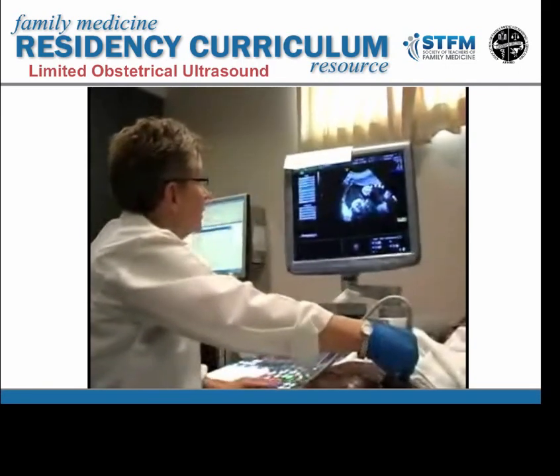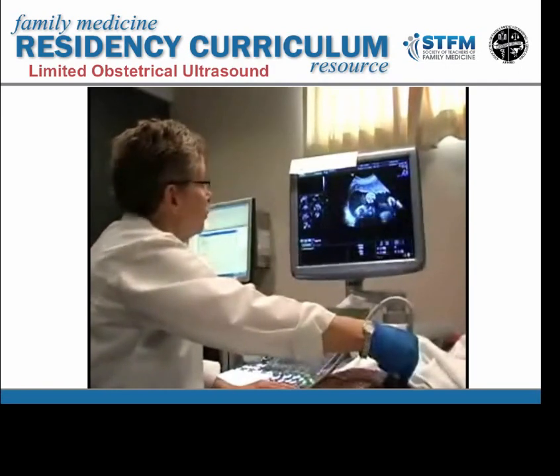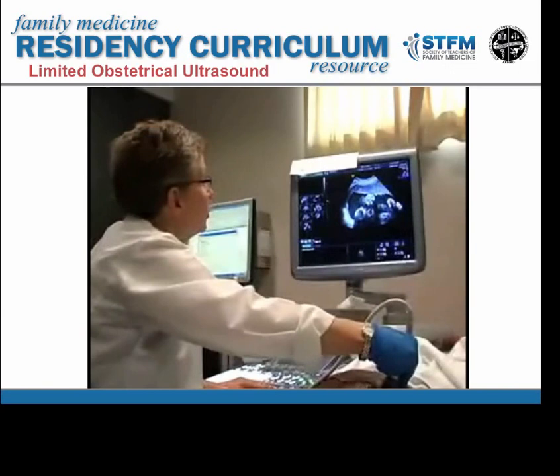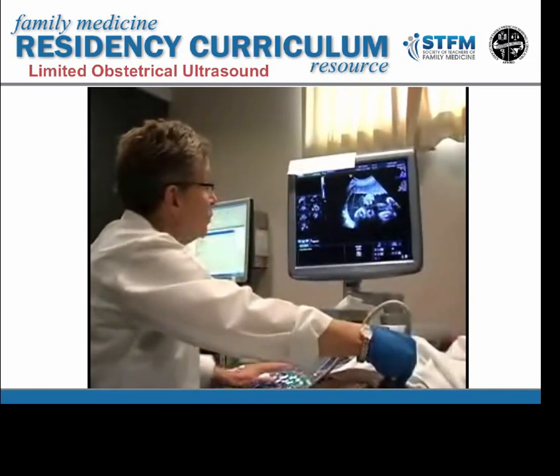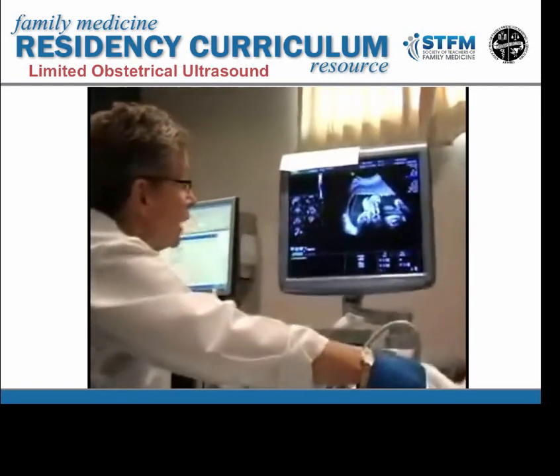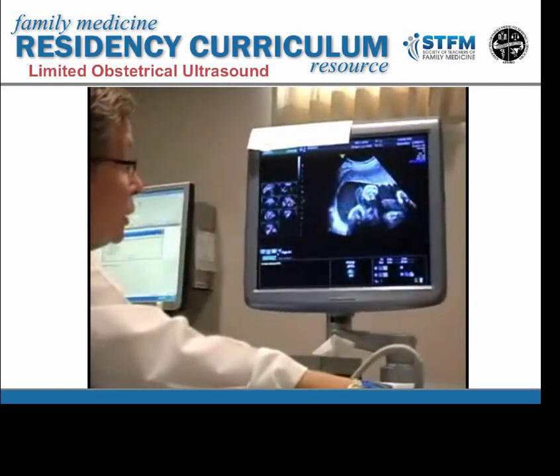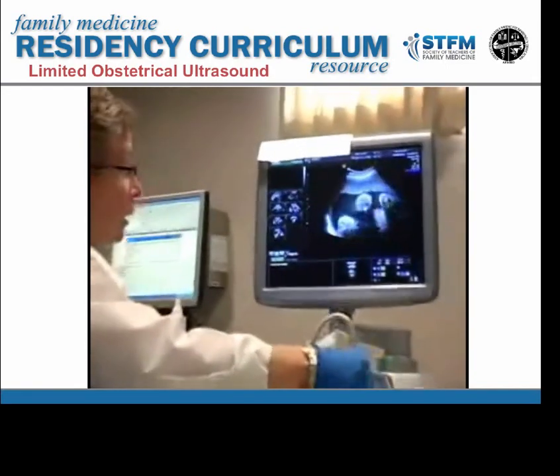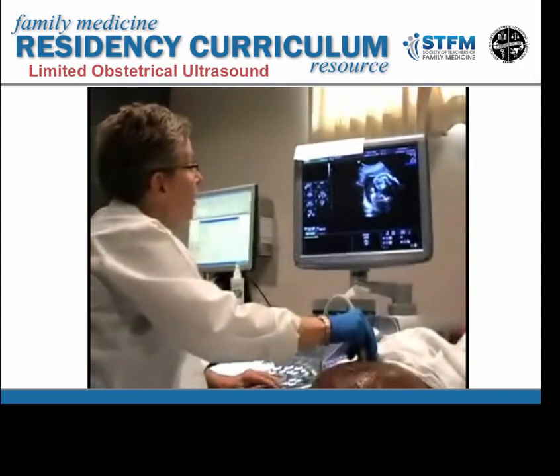The second thing that's important when you're going through it is that you make sure that you're not going through umbilical cord. Now this patient is very thin and you can actually see where the umbilical cord is, but sometimes in heavier patients it's tough to see, and you may want to put on some color just to say you're not measuring through the umbilical cord, because when your resolution is poor, it's going to be difficult to tell amniotic fluid from umbilical cord. I'm going to go over next to the right upper quadrant.